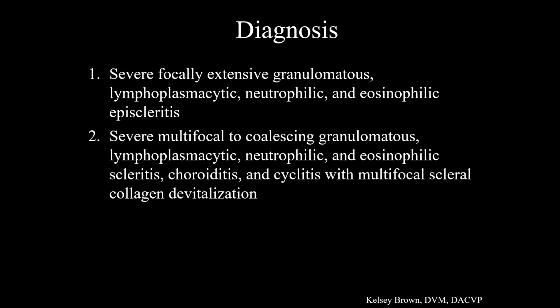Has also been called granulomatous scleritis, which is also an immune-mediated condition. It often does also bring in a lot of macrophages. And is also usually paired with scleral collagen devitalization, suggesting that maybe the scleral collagen is kind of the target antigen for this immune-mediated process. In a lot of cases, we kind of see these two conditions, just one or the other, but they both are considered immune-mediated, histiocyte-rich inflammatory processes. So possibly they just represent kind of a spectrum of a similar pathogenesis.